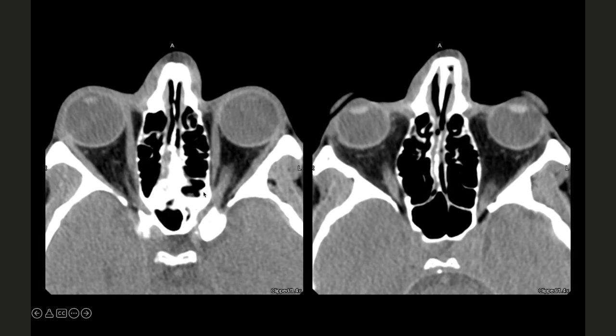And then, of course, the walls, because we talked about how CT is good for that. This is a soft tissue algorithm, so I have changed it in a way I can see the soft tissue density. You can acquire the algorithm as a soft tissue or bone, but after we acquire it, we can also tweak it based on the windowing and leveling. However, the resolution will be different, so it is nice to know upfront what I'm trying to do, because if it's a fracture, I definitely need my bony algorithm. Usually we do get both algorithms, a soft tissue and a bone, just to be on the safer side.